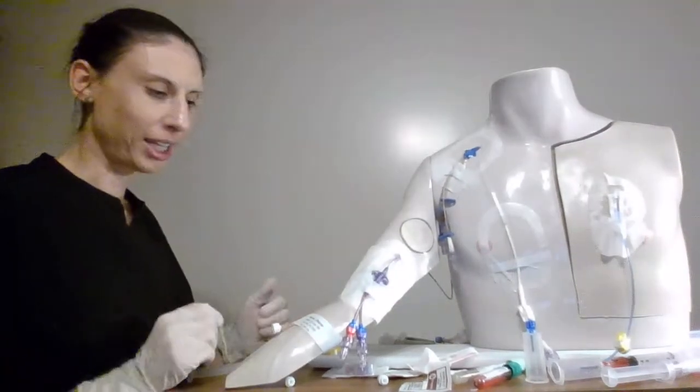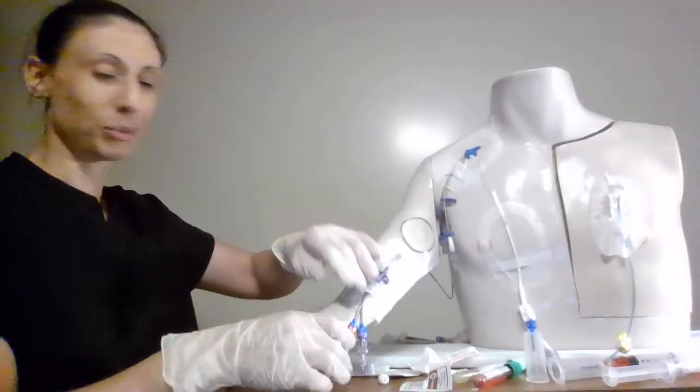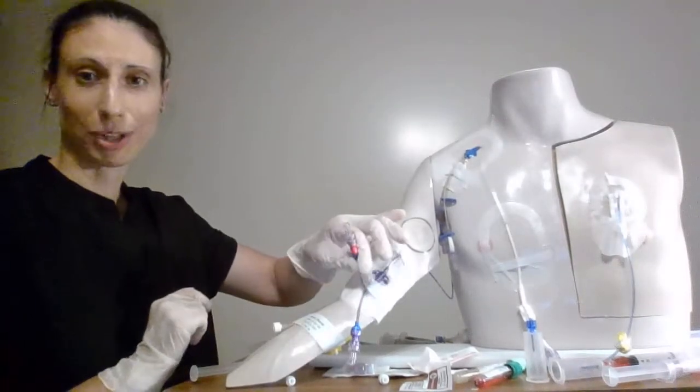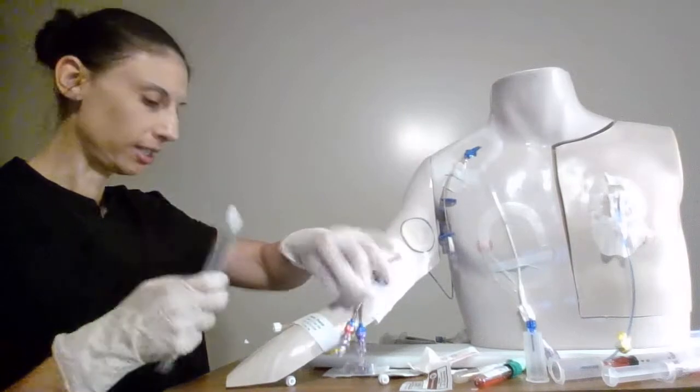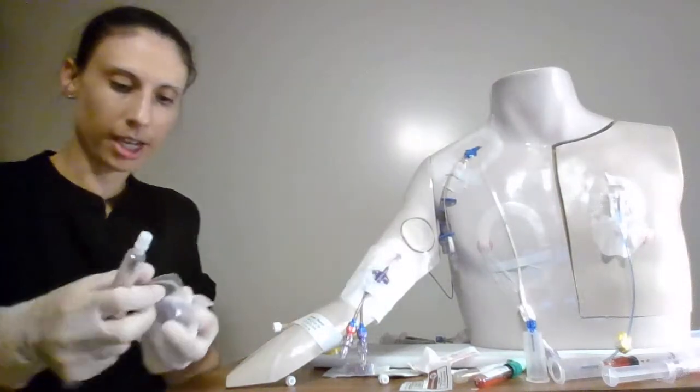Now for a cap change on a PICC really easy as well. We have no heparin to draw out. We have no clamps. So very easy. We just need our normal saline syringe. We need an interlink cap.